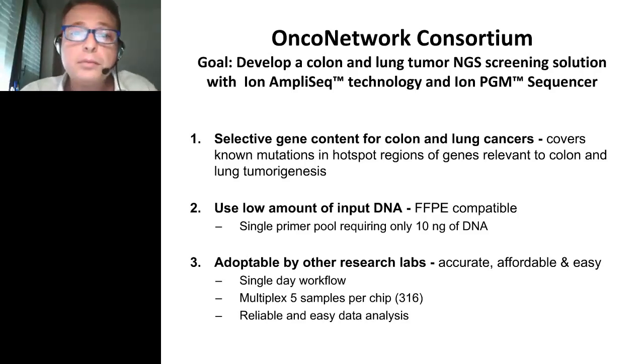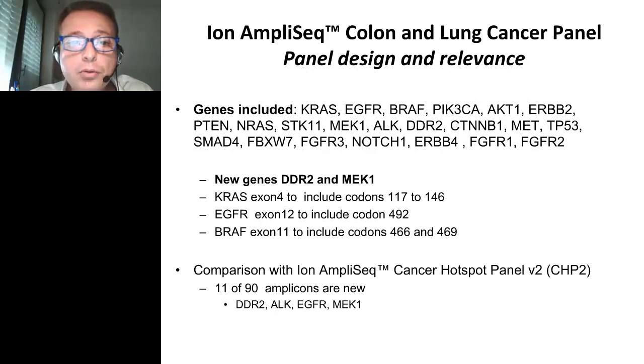The study that we performed to validate this panel was organized in 3 phases. The first phase was aimed to assess reproducibility and accuracy of the panel, and in this phase the same 5 control samples were analyzed in 7 different labs. The second phase aimed to assess concordance, and therefore 10 blind samples were assessed by each of 6 labs.